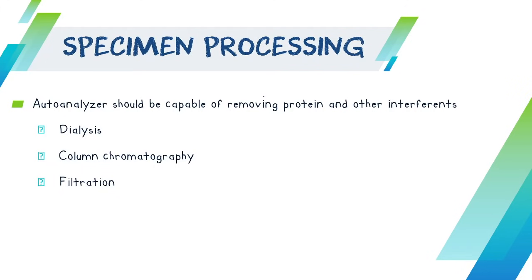Or for example, in your blood banking, when you do cross-matching, you wash your blood 3 times to remove protein and other interferences.